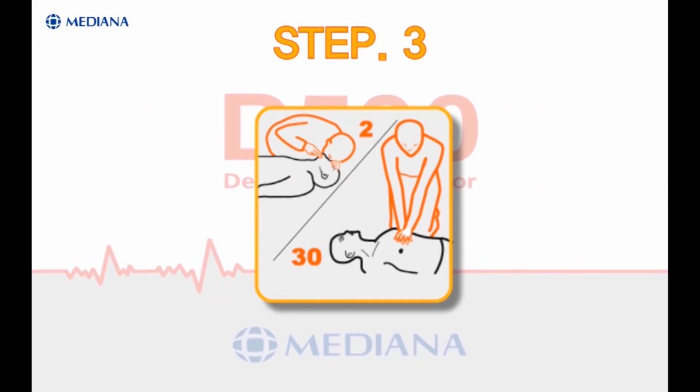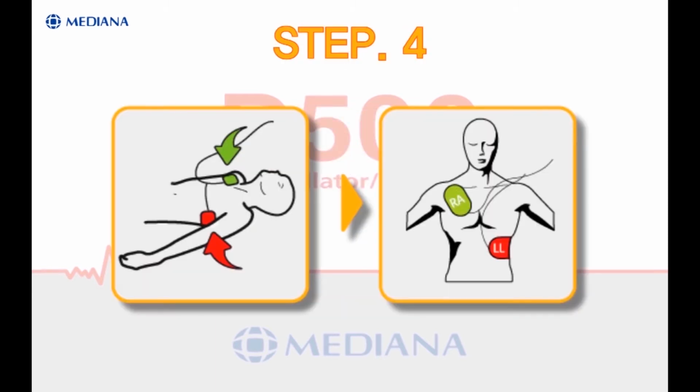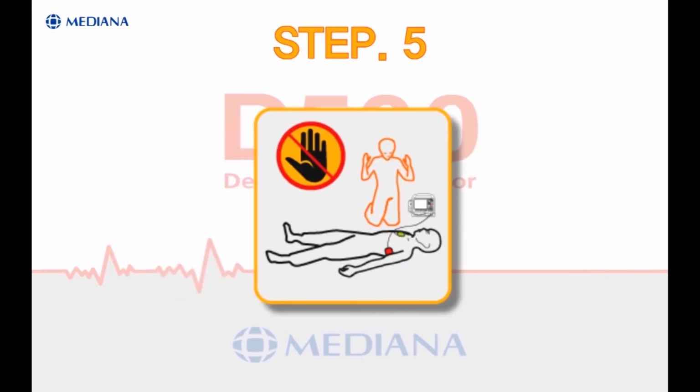Begin CPR. Give 2 breaths. Stop CPR. If pads are connected to defibrillator monitor during step 3, defibrillator monitor will go on to step 4 directly. Remove clothes from the patient's chest. Place pad exactly as shown in the picture. Press pads firmly to patient's bare chest. Analyzing heart rhythm. Do not touch the patient. Shock advised. Charging.